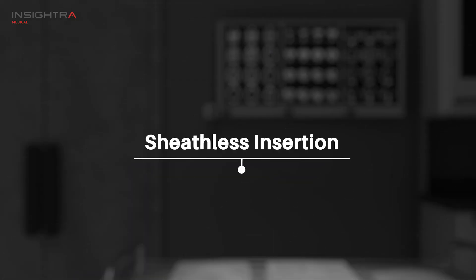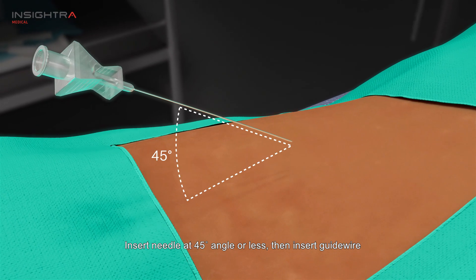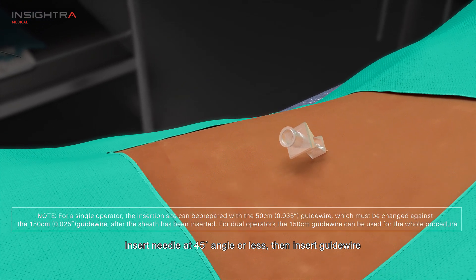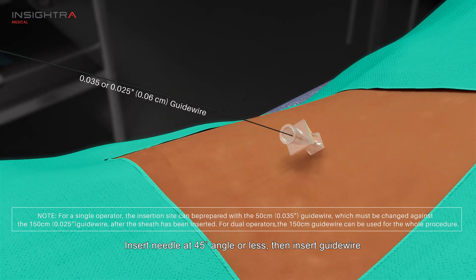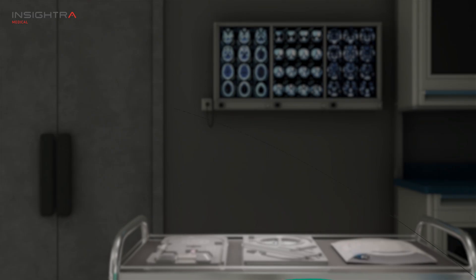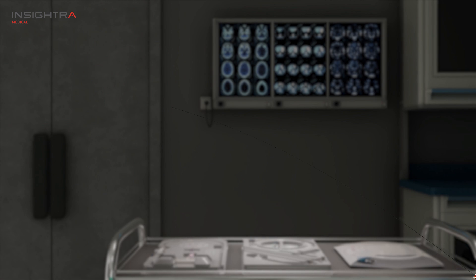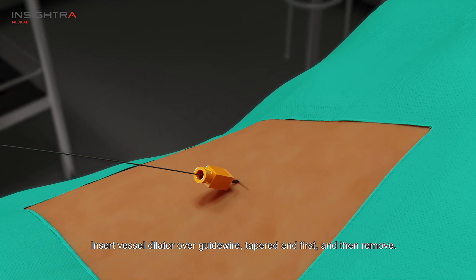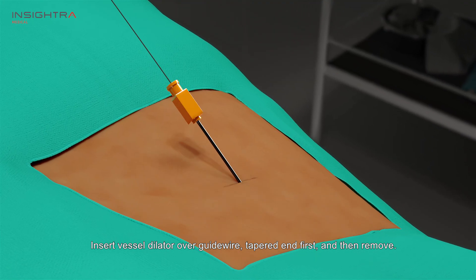Sheathless catheter insertion. Insert needle at 45 degree angle or less, then insert the guide wire. Insert the vessel dilator over the guide wire, tapered end first, and then remove it.